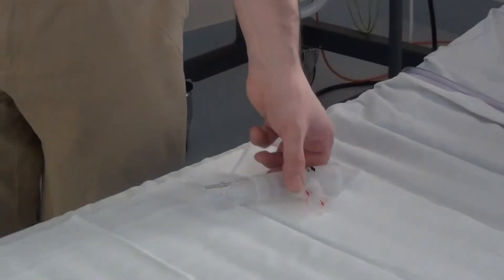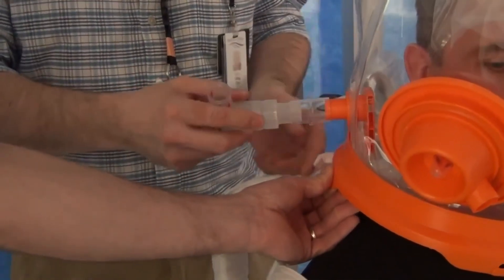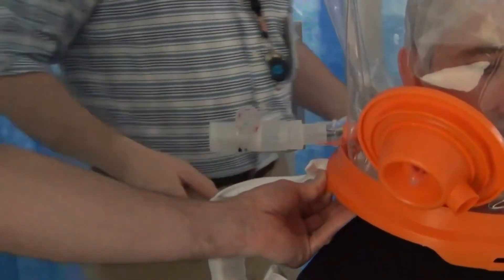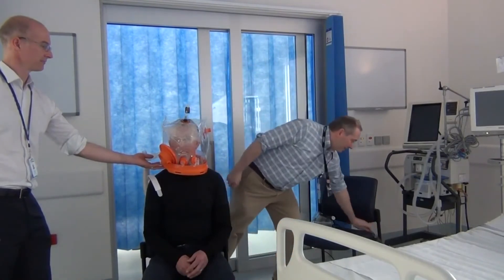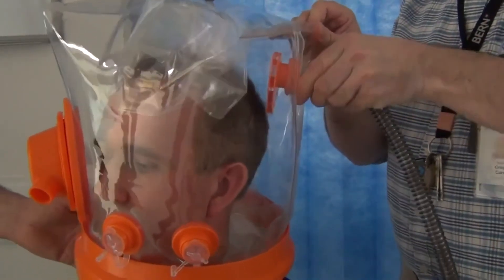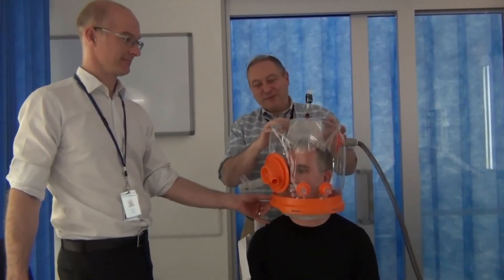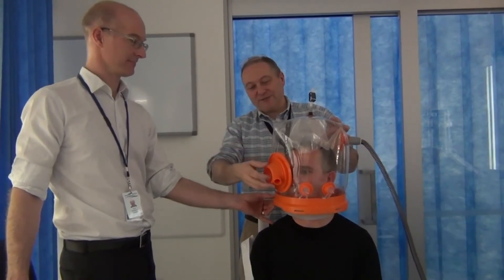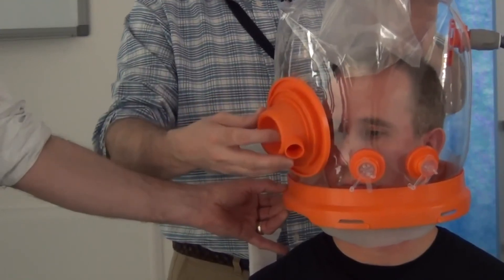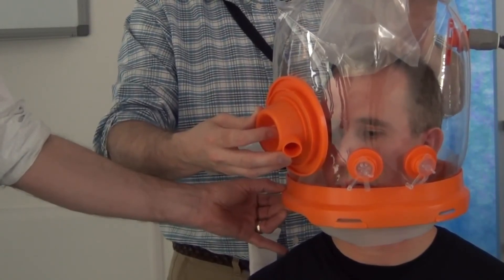Next we're going to place our patient onto CPAP. We're going to apply the CPAP valve to the expiratory port of the helmet — just apply a little bit of pressure there. Then we're going to apply the standard CPAP input to the inspiratory port of the helmet. You can see the helmet is already inflating. Having connected the CPAP, we now check that the free breathe valve is completely closed. We can feel with our hand for gas flow out the exhaust, and to double check we press the safety toggle switch for three seconds to completely close the valve.